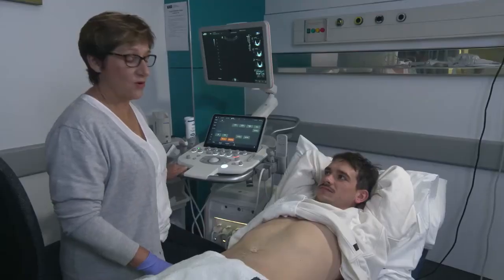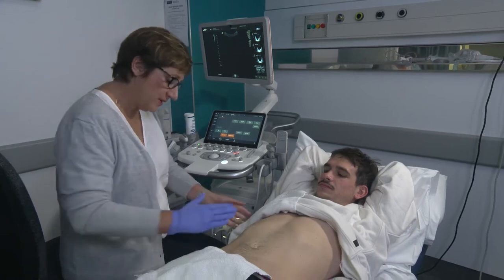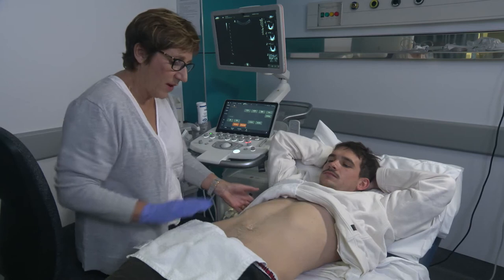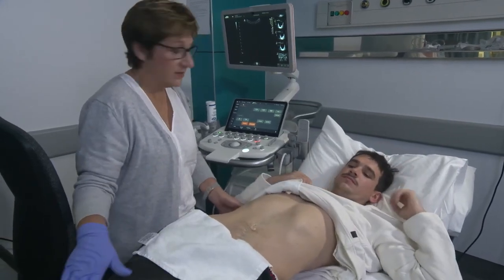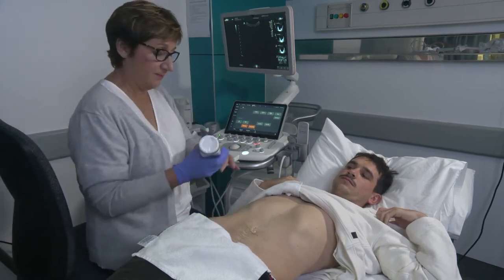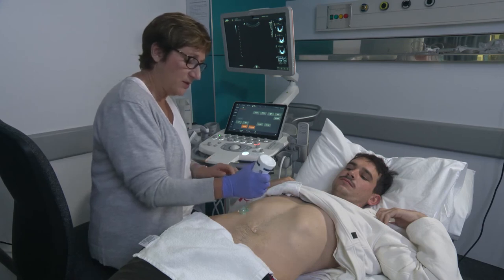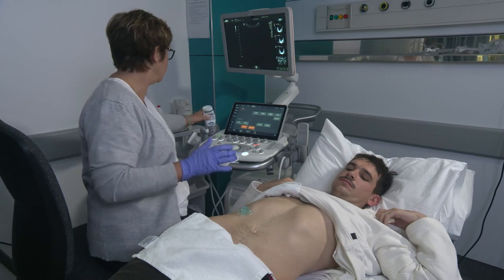We're now going to go on to assess Bruce's right kidney. Bruce, can you just move slightly towards me and turn your body away so that you're in a decubitus position. Again, making sure that the leg is stretched straight out so we can get a non-squashed organ up here. Apply gel to the skin surface, making sure that we do not touch the skin with the gel bottle.